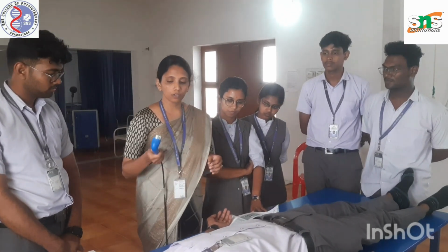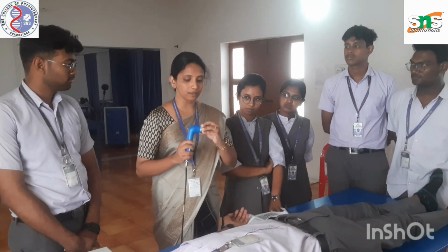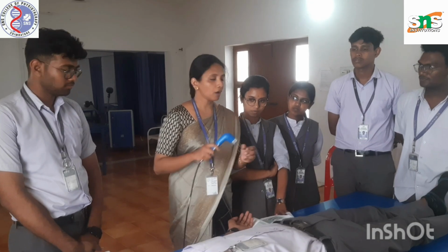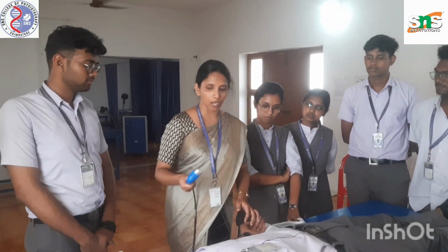So this is the transducer head. This transducer head is having a crystal inside it, so that will be producing the ultrasound. Now we are going to see what are the techniques that we can apply with the help of ultrasound.